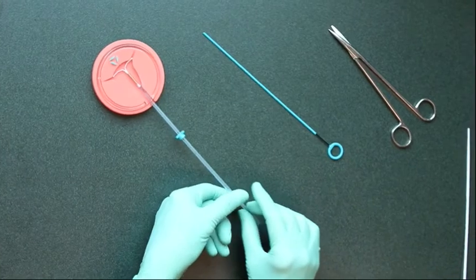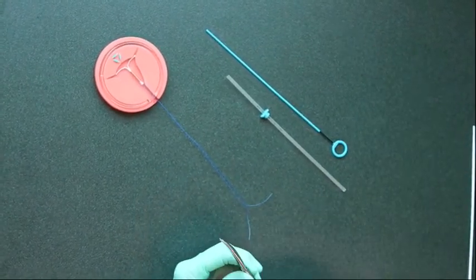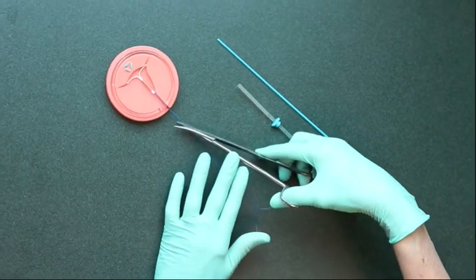Pull out the plunger and then the insertion tube. Then you can cut the string about 2 cm.